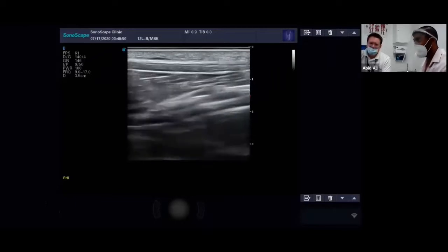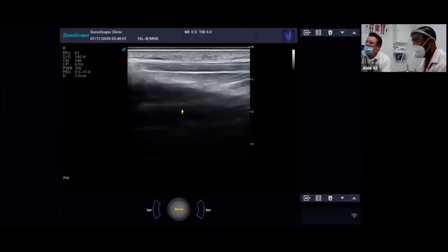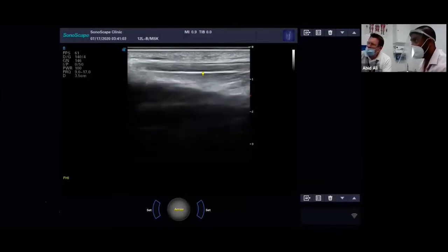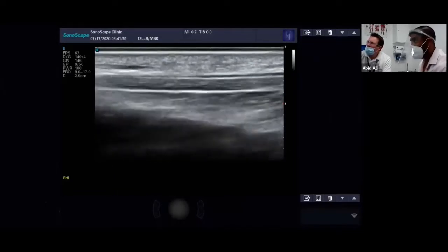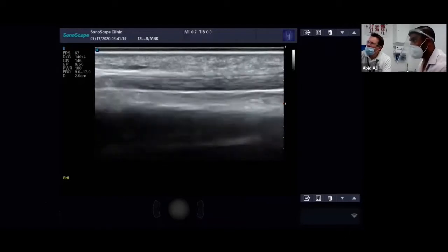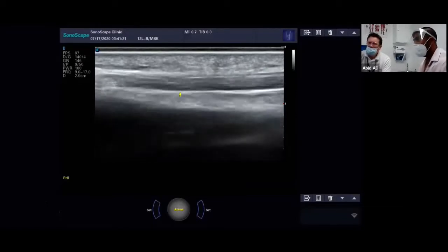So if I was looking for a tear in this tendon, linear or transverse, I would apply some plantar flexion. Can you see I'm stretching the tendon here? So you want to interrogate the internal fibers by putting some tension onto it. Gapping is often going to make tears and injuries like that more apparent. And you can see the layers moving.